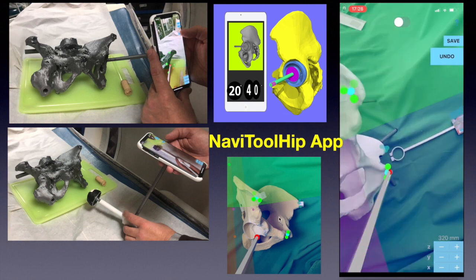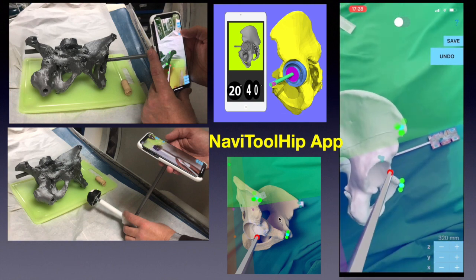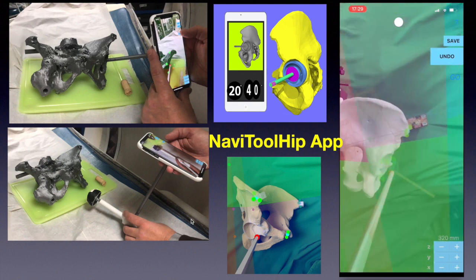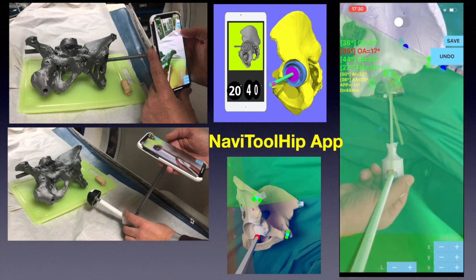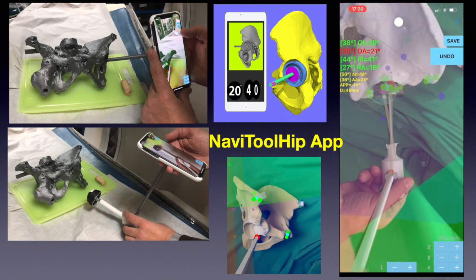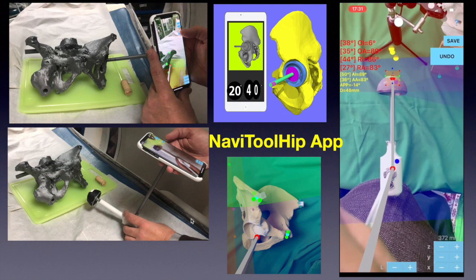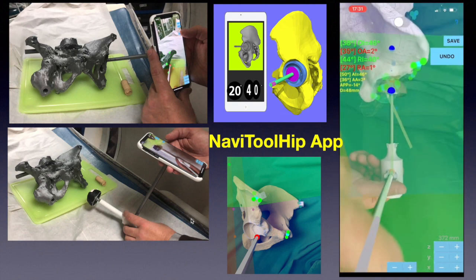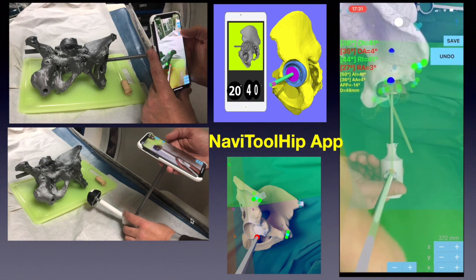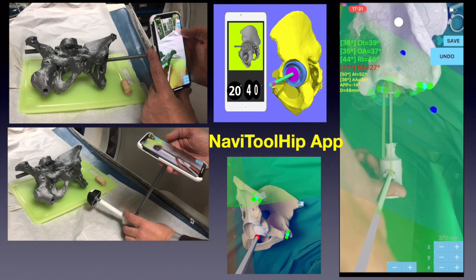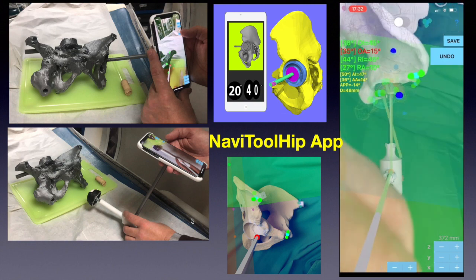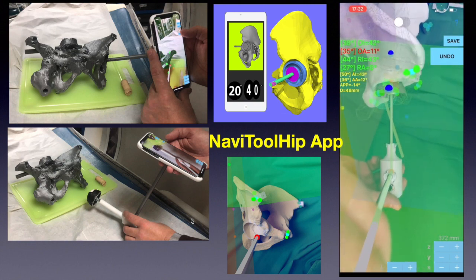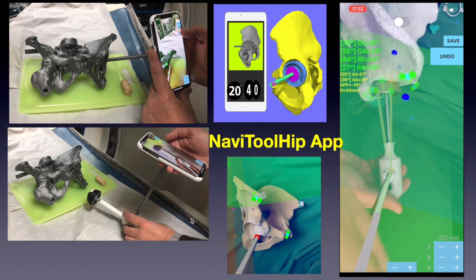By registering with the iPhone certain anatomical landmarks in augmented reality and by attaching it to the reamer or later to the inserter, the surgeon can be oriented by seeing in real time anteversion and inclination on the iPhone screen, thus helping adjust objectively the anteversion and inclination of the cup either during sequential reaming or during final impaction of the cup.